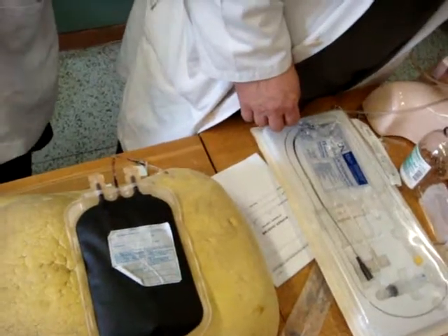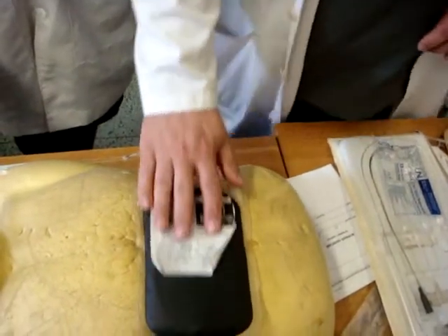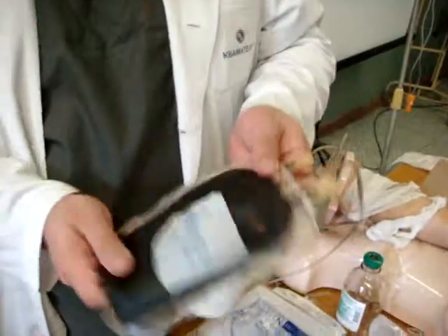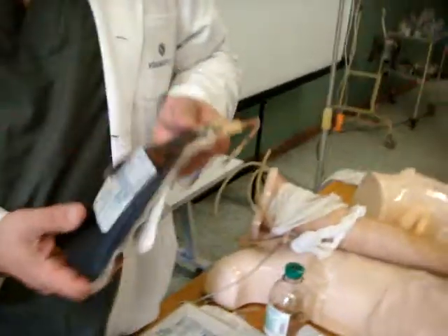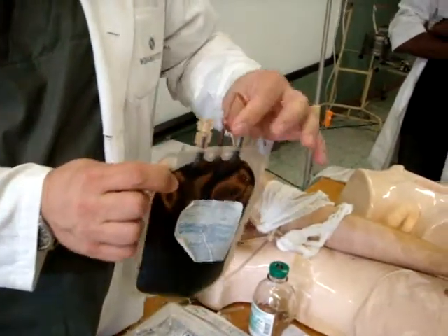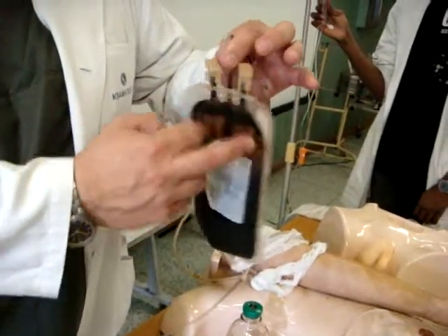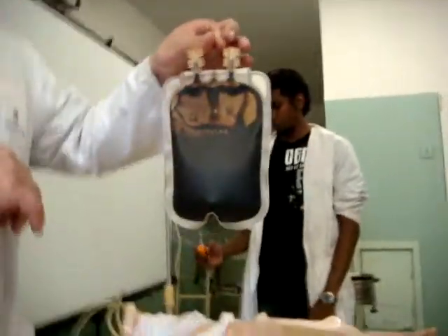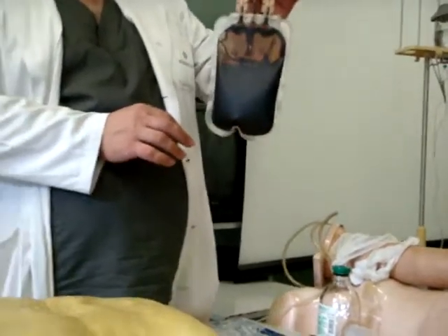You should answer: what is wrong with this bag? First, you provide examination of the first condition — the temperature. Yes, it must be four degrees. And color — right here, in this zone. If you have normal condition, this one must show color loss. Yes, if you see dark or red color, it's a sign of something abnormal.